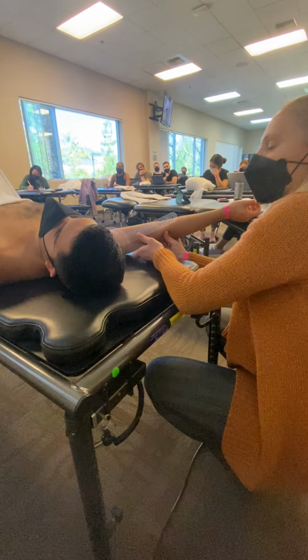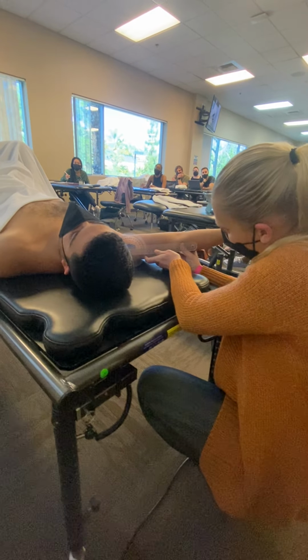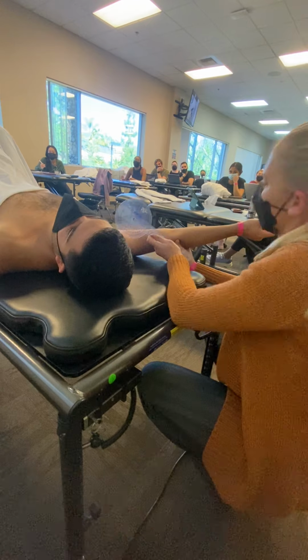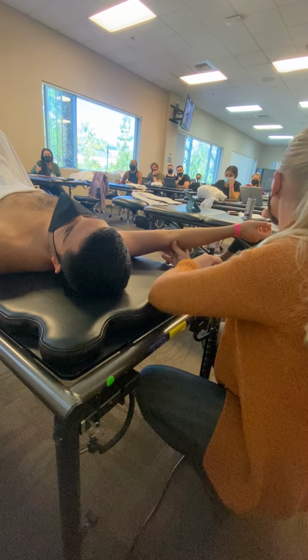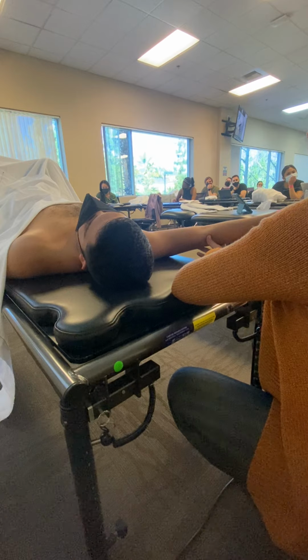You can also still do the method where you measure the acromion and measure that angle, and he's at 13 degrees. The angle from the table is 13 degrees, because I'm measuring from the table. It's kind of a horizontal abduction, but just angle from the table.